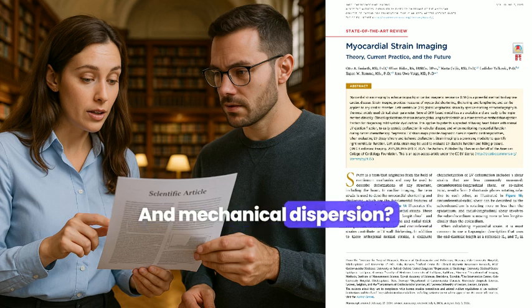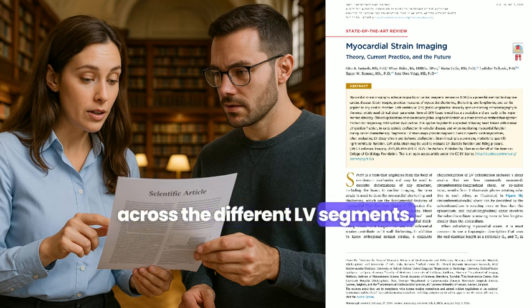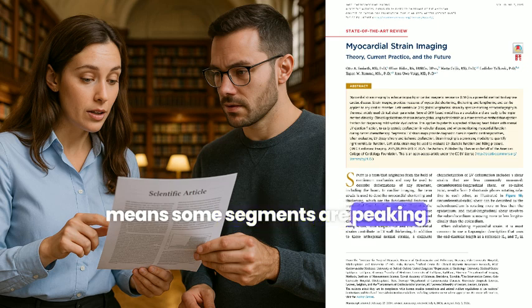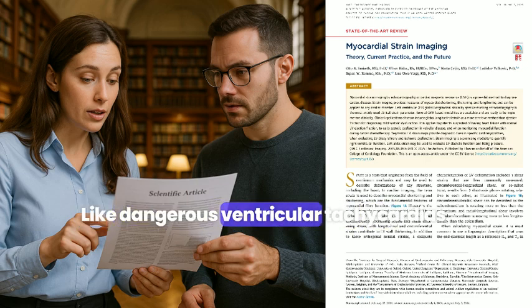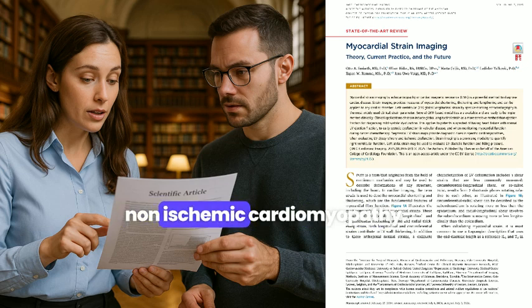And mechanical dispersion, what's that telling us? Mechanical dispersion is about how uniform the timing of contraction is across the different LV segments. High variability, large dispersion, means some segments are peaking much later than others. And that's bad. It's been linked to increased risk of arrhythmias, like dangerous ventricular tachycardias, first noticed in long QT syndrome, but also seen post-MI and in non-ischemic cardiomyopathy.